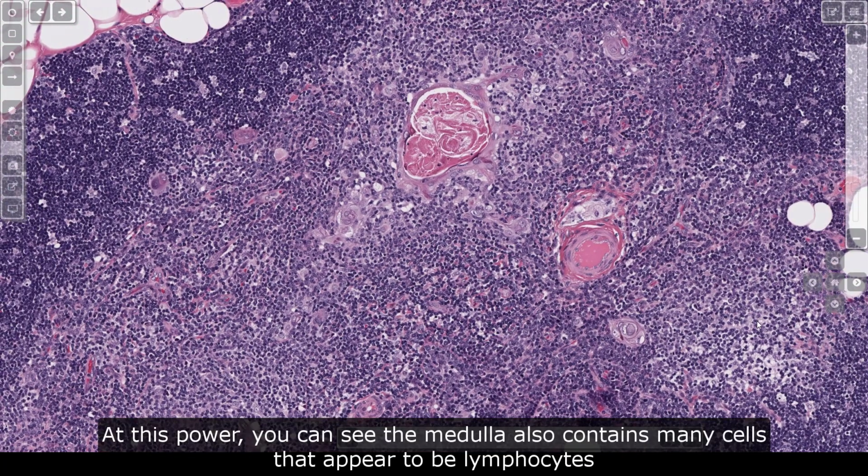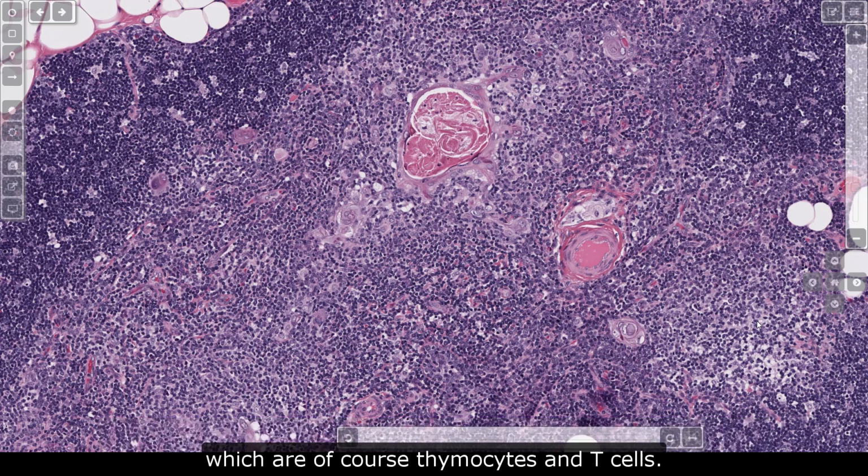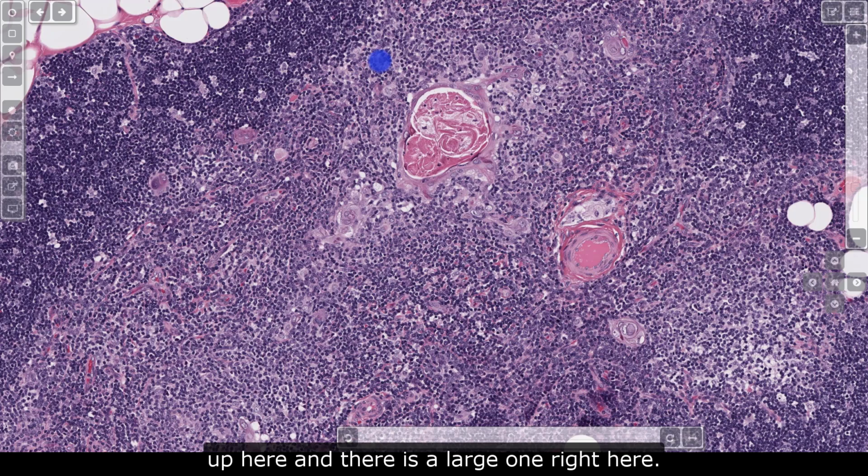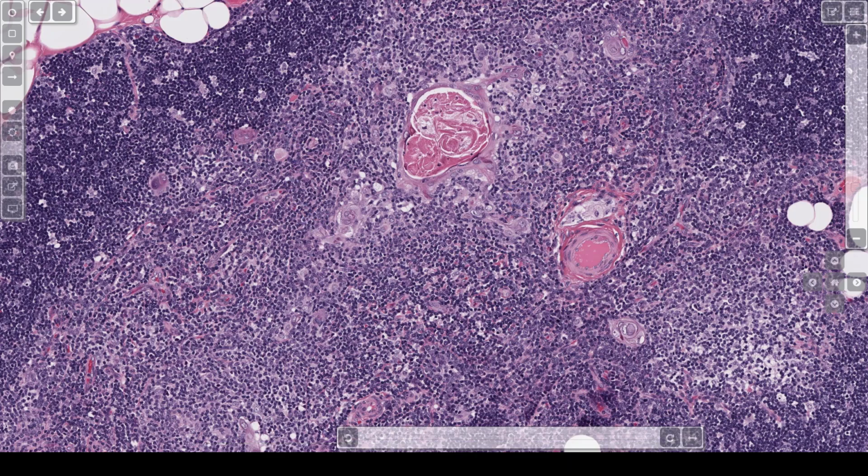At this power, you can see the medulla also contains many cells that appear to be lymphocytes, which are, of course, thymocytes and T cells. The medulla also contains Hassall's corpuscles. There is one Hassall's corpuscle right here, there is another one up here, and there is a large one right here. Let's take a closer look.